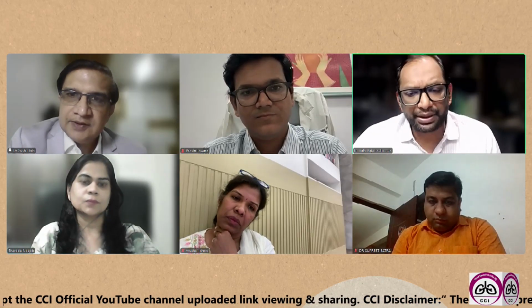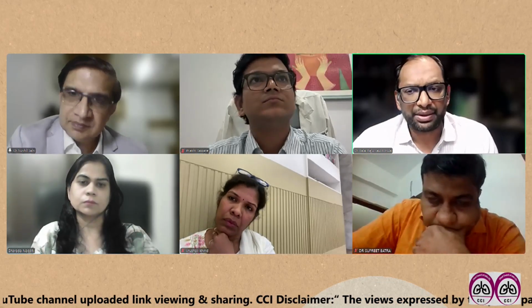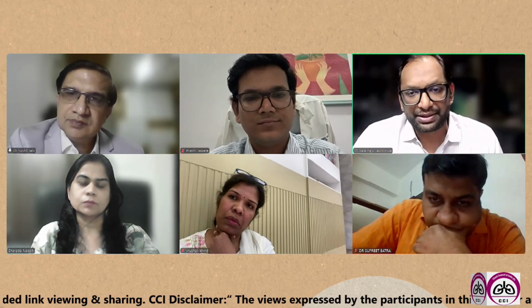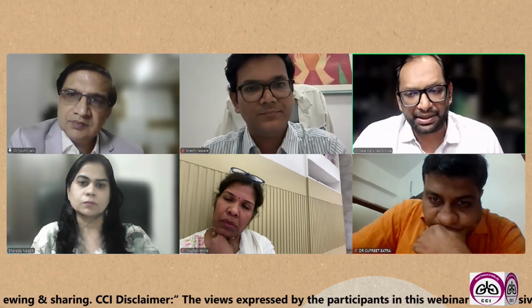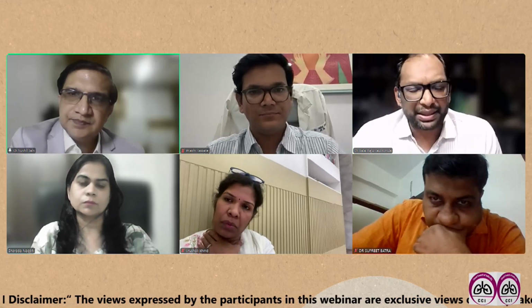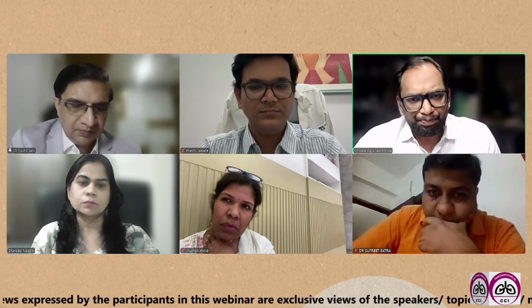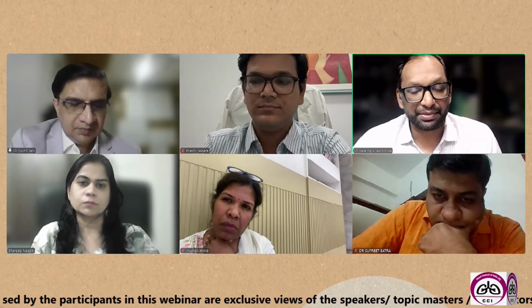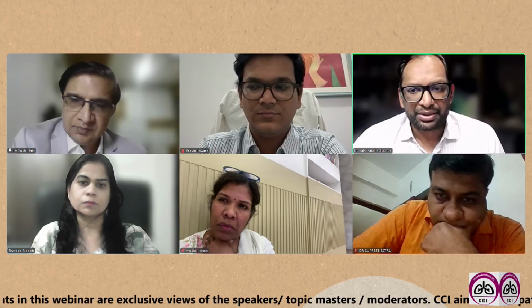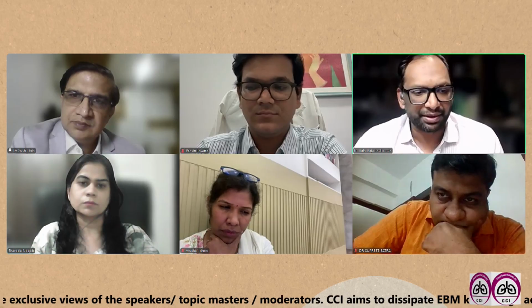So you can broadly divide this into 2 categories. One is the staging part and one is the diagnostic part. If you're doing a staging EBUS and the lymph node size is less than 10 mm and it is PET positive, 100% you're going to sample it. But there are technical challenges when you're doing less than 10 mm, we'll come to that. The second point is if the lymph node size is less than 10 mm and it is PET negative, still we sample in a staging EBUS. The challenge is to do a very good sampling for that less than 10 mm lymph node.